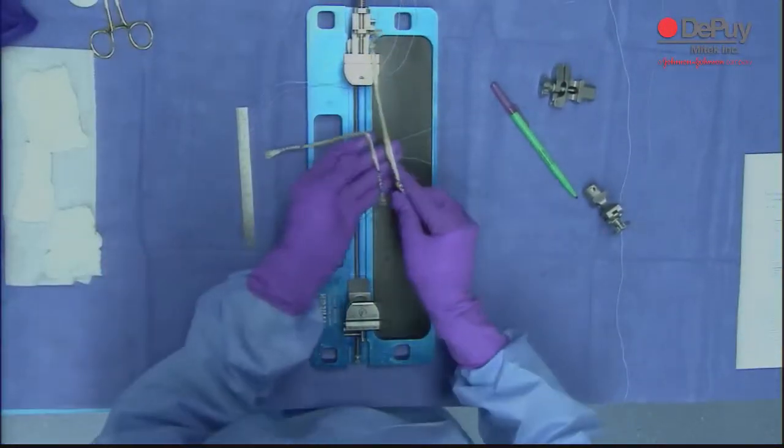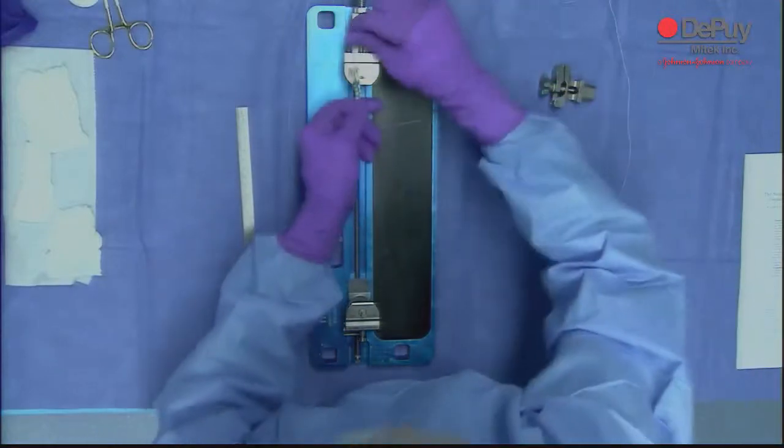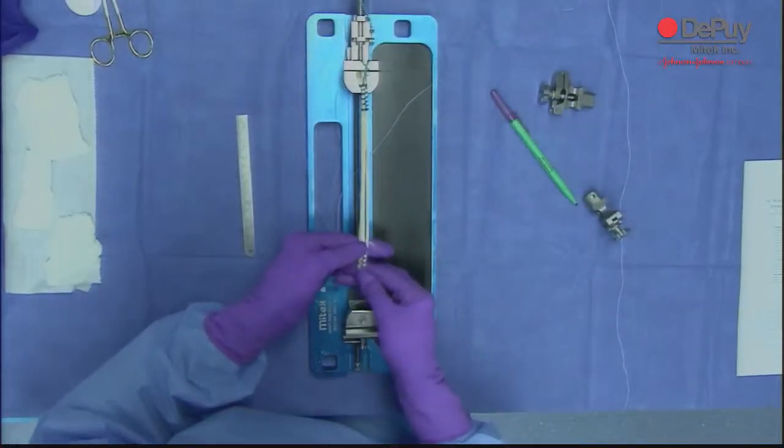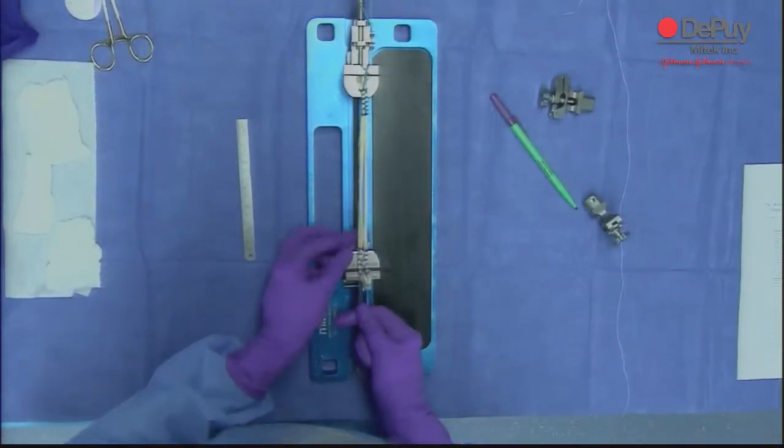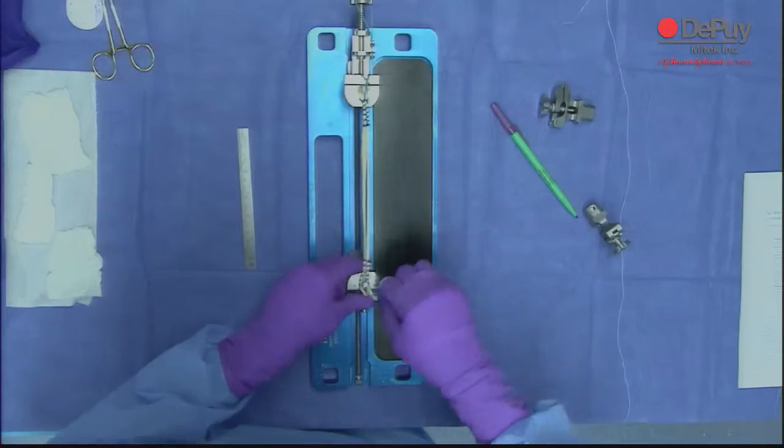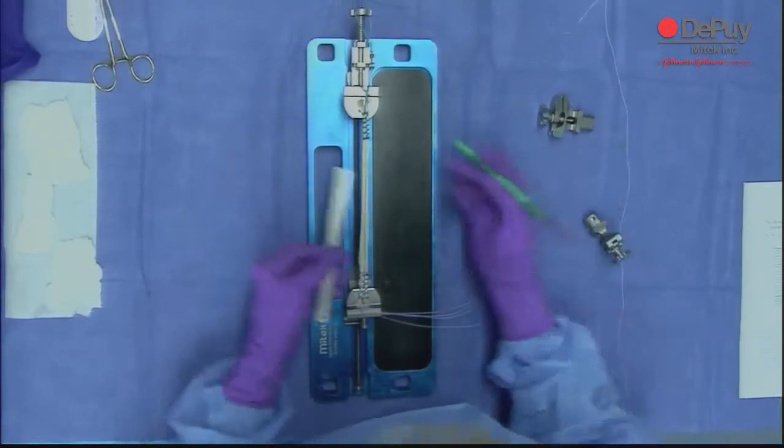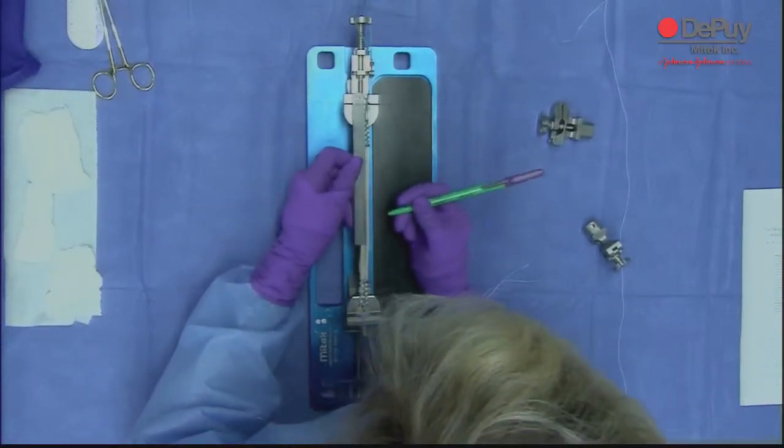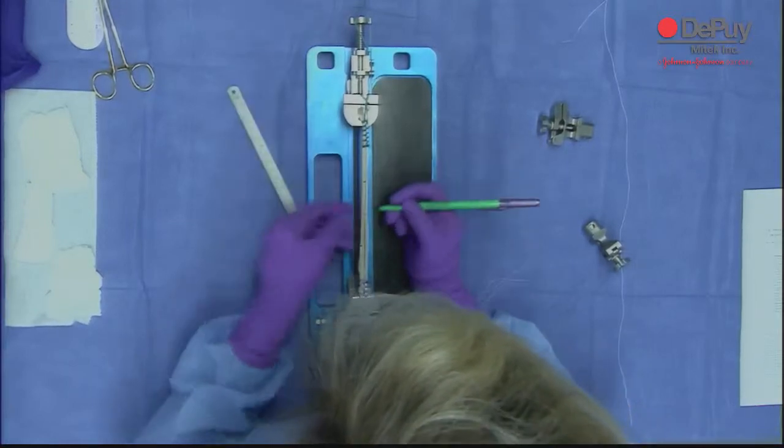As you can see, I color-coded this graft. I put the green on one end because you want two distinct ends of the graft. One's going to be your anteromedial and the other portion is going to be the posterolateral bundle. So now I have my middle mark, which is right there. I'm going to place that middle mark at 35. I'm going to mark it at 0 and 70. And now I'm ready to go.